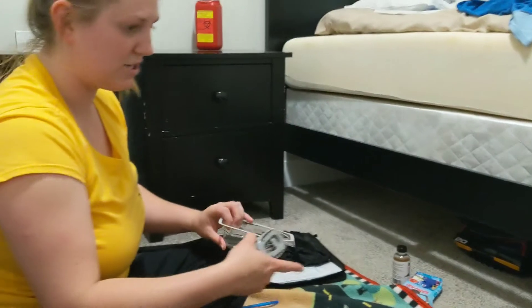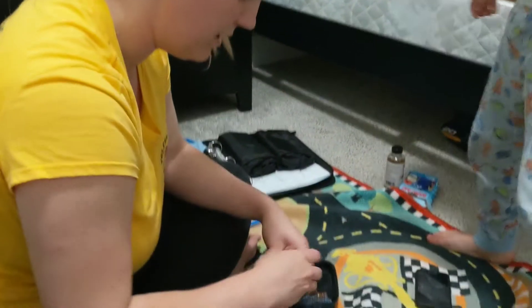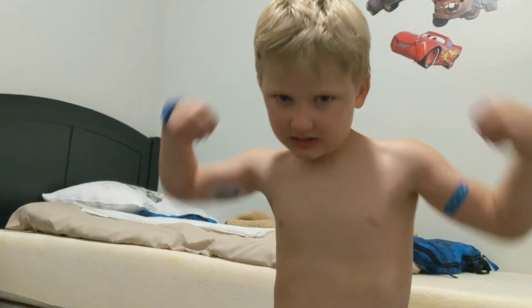Actually, that's not quite it — since the sensor is in a two-hour warm-up, you won't have any blood sugar readings for two hours. You need to check his blood sugar manually before you let him go back to bed or play or whatever he's doing. So let's check your blood sugar, Riker.